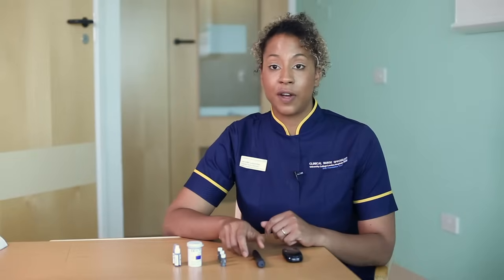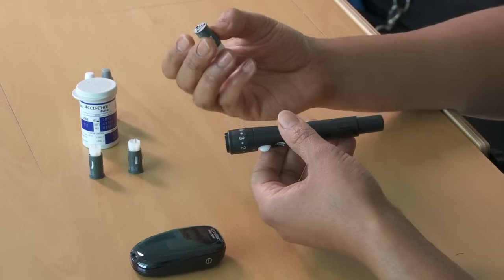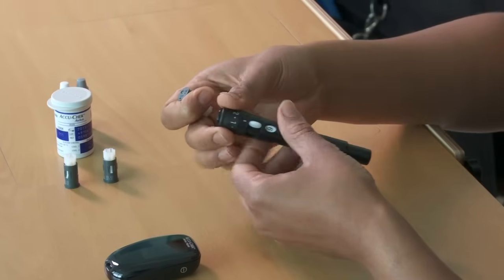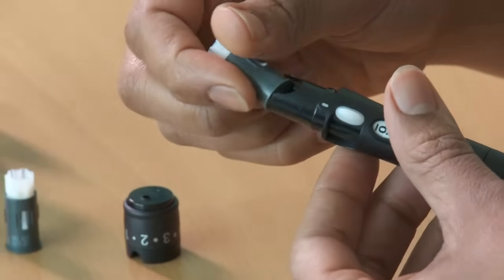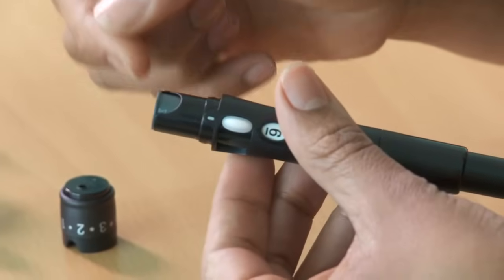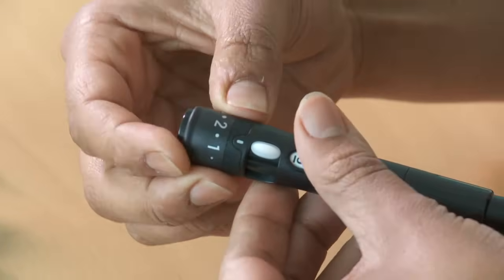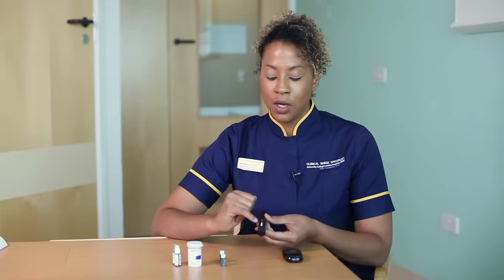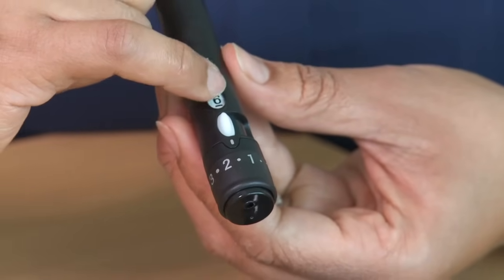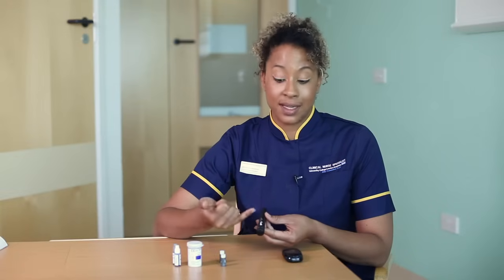There are a few things that we need to do first to prepare. We need to load a new drum, which has got the lancets in, which will prick the finger. Just take the cap off and place the drum into the pen. You can only put it in one way and you'll just hear a click as it goes into place, then pop the cap back on. You'll notice there's a number six in the window, and this corresponds to how many new lancets there are remaining in the drum — we've just put this drum in, so there's six.